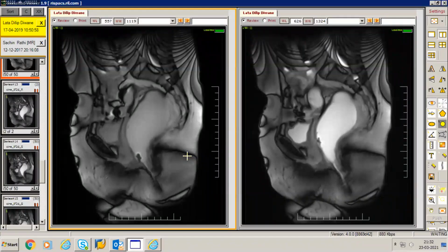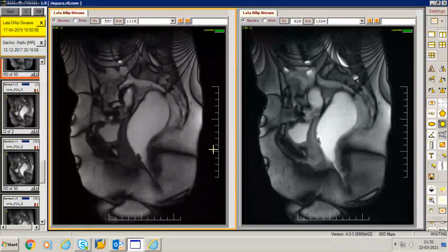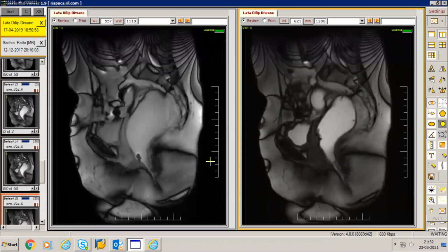And a classic example is your TrueFISP or your TurboFLASH 2D sequences, your FLASH 2D sequences which have a higher flip angle than normal. So normally most T1 gradients have a low flip angle. If you increase the flip angle, typically above 45 degrees, it tends to be more T2 weighted. So that's what he's using. He's using a cine T2 weighted 2D gradient echo sequence. We don't need to use a 3D sequence, and that's how we do it.